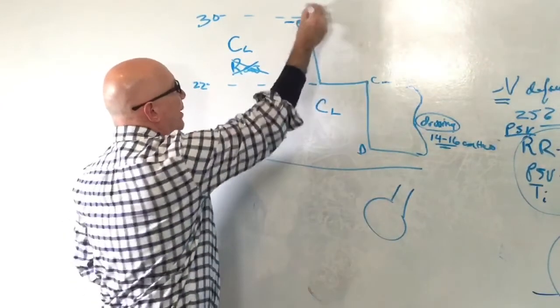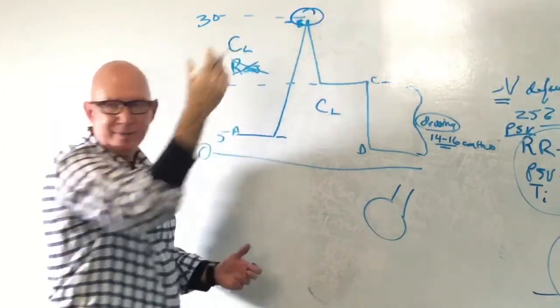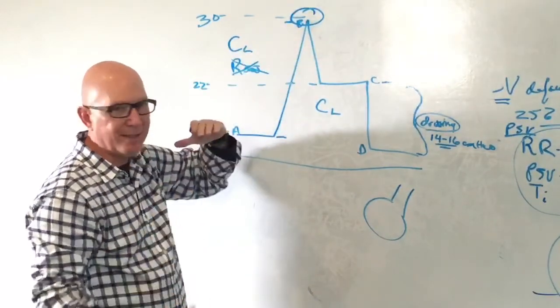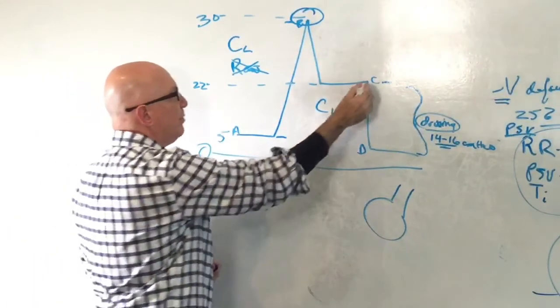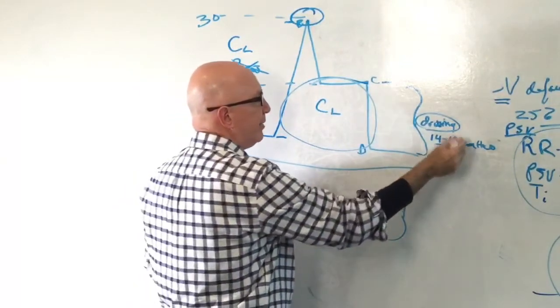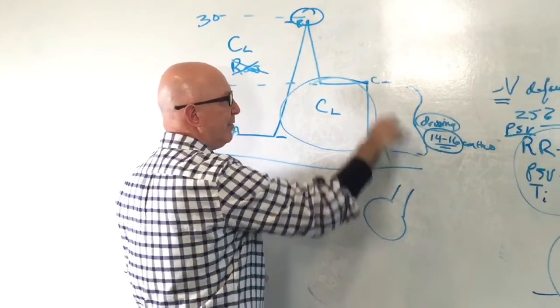Because this pressure here is, your alveoli don't see this pressure. It's measured actually at the mouth as far as your ventilator is concerned, and it actually gets less and less and less as you get down your airways because it's a dynamic pressure. However, this one is the pressure that's throughout your whole airways and that your alveoli are exposed to. So as you start thinking about driving pressure, think about the difference from here to here.